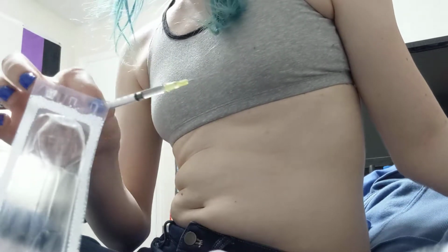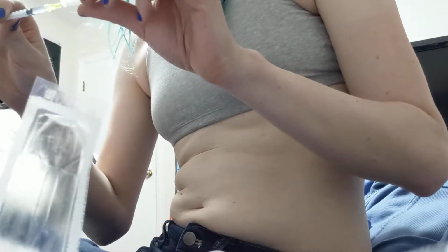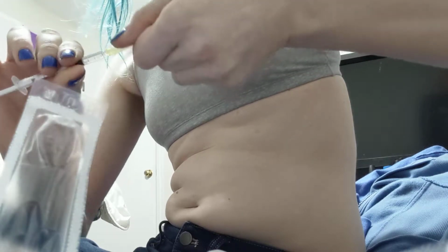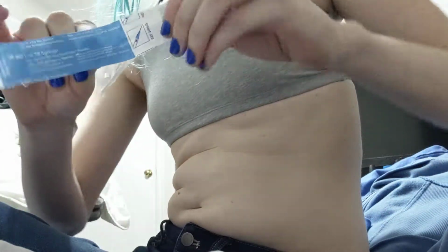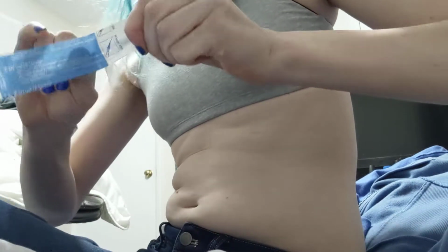Now we're actually done with the needle you're drawing it up with, so you want to recap that and take that needle off because we are done with that needle itself. That would be discarded. Then we're going to take this filled syringe, stick on the smaller needle we'll actually do the injection with, and keep it there for a sec.